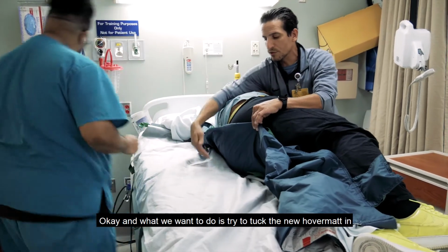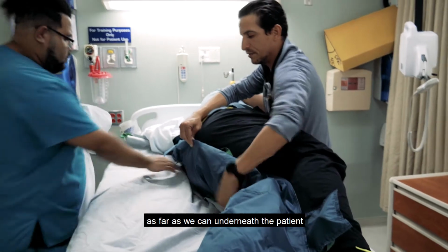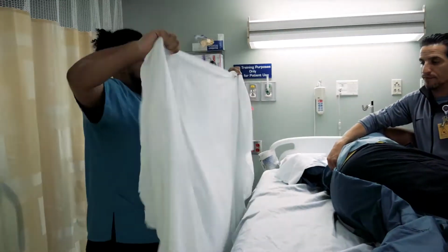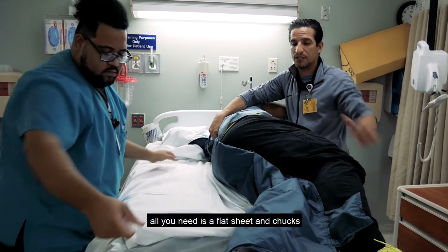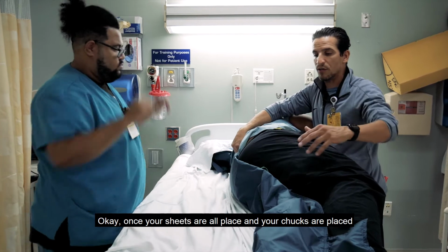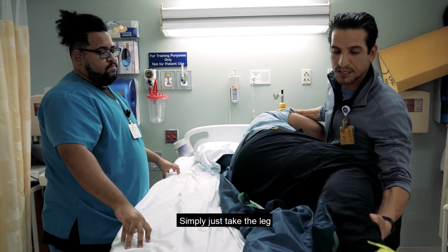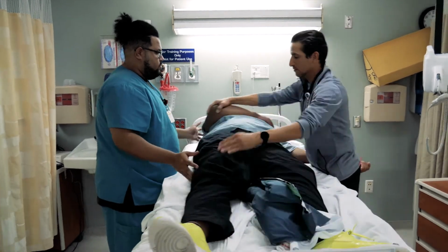Okay, and what we want to do is try to tuck the new hover mat in as far as we can underneath the patient. Okay, so before we put the sheets on, we want to make sure everything is lined up. And remember, when using the hover mat, all you need is a flat sheet and chucks, no draw sheet. Okay, once your sheets are all placed and your chucks are placed, now we're going to place the patient back on their back. Simply just take the leg and slide it back and return the arm.